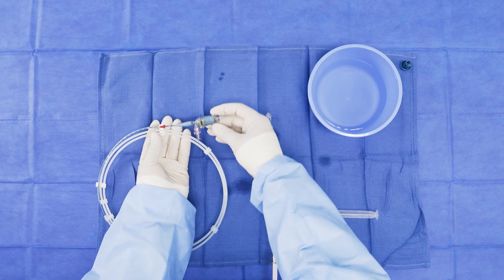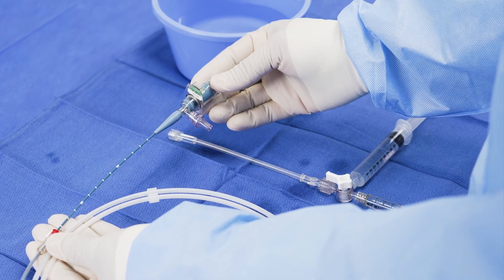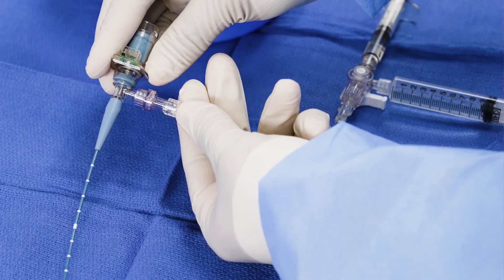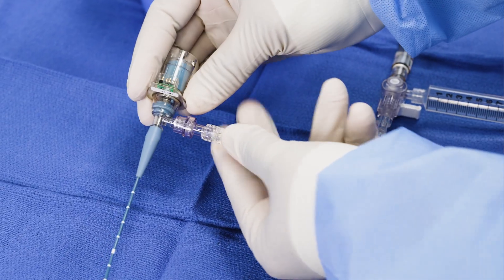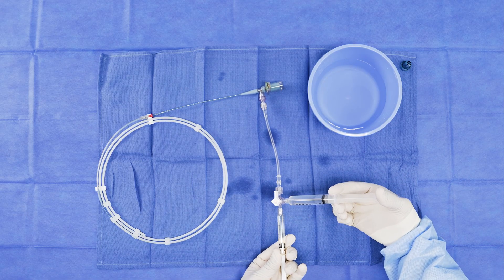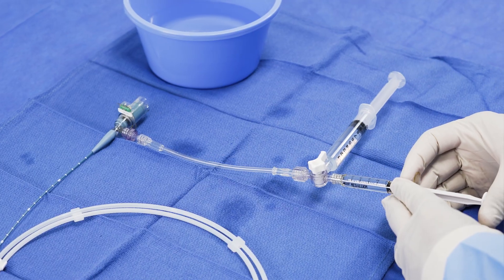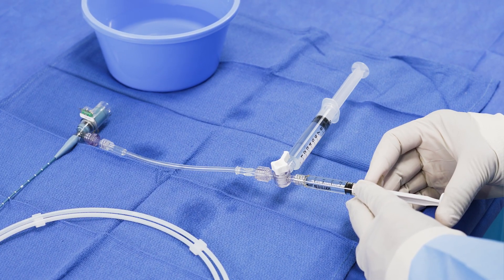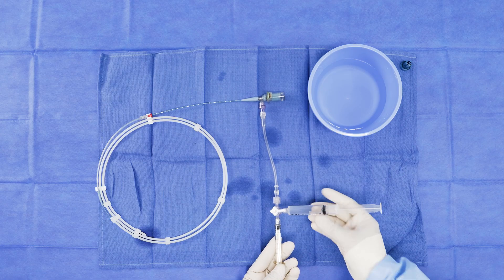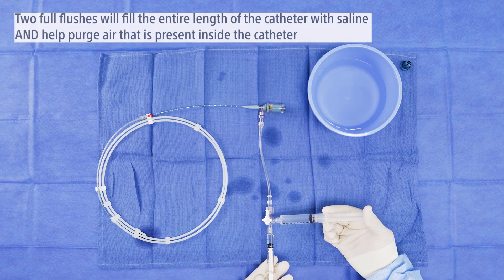Retract the movable imaging core completely to the proximal position by carefully opening the telescoping shaft. Connect the extension tube and syringes to the catheter. The 10cc syringe can be used to refill the 3cc syringe as needed. Using slow, steady pressure, flush the catheter twice to purge bubbles. You want to see a drip of liquid from the tip of the catheter hoop, not a spray. Use the 10cc syringe to refill the 3cc syringe for the second flush.